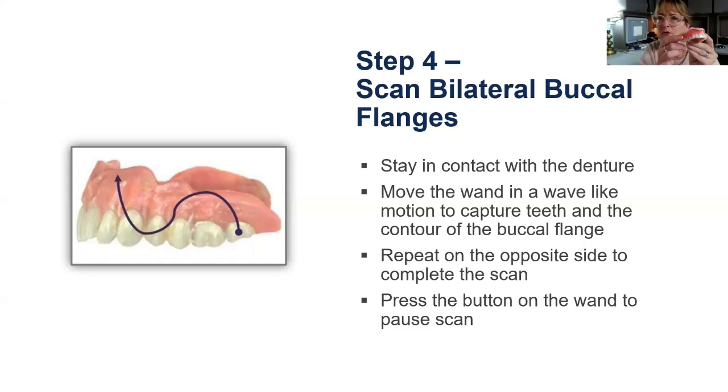When you're capturing the borders, as in the picture, you want to capture some of the border and then come down to the buccal incisal cusp, come back up to the border, back to the cusp. And it's very smooth. It's smooth and steady. It's not an abrupt twist. That's the most difficult thing I think I have explaining to people, is it's a smooth, steady process.